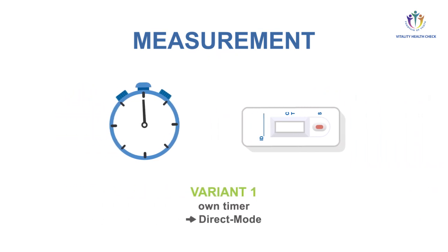For variant one, own timer and immediate mode of the VHC reader, set your timer to 15 minutes.